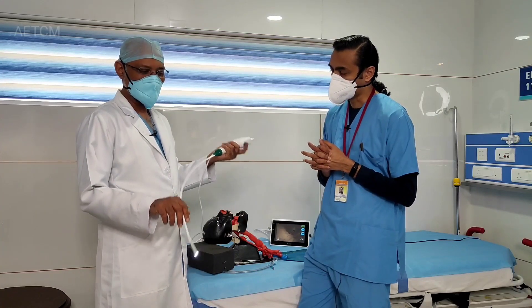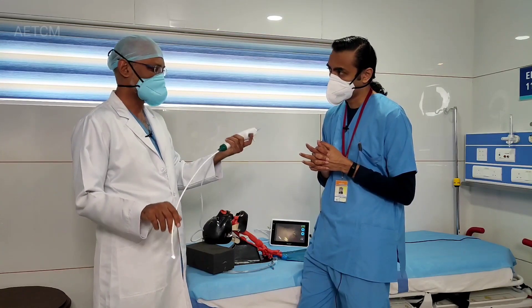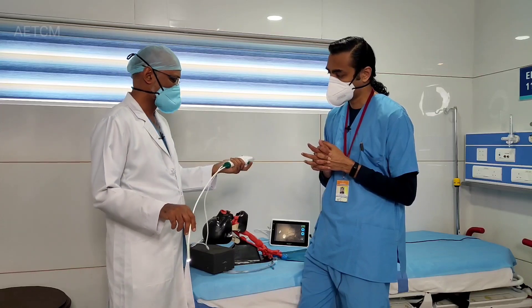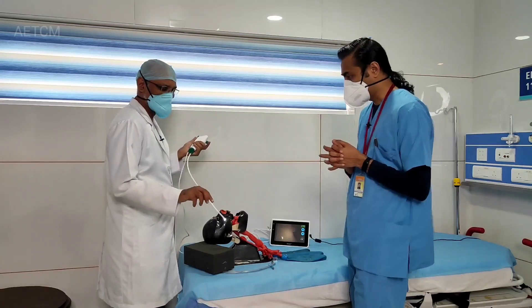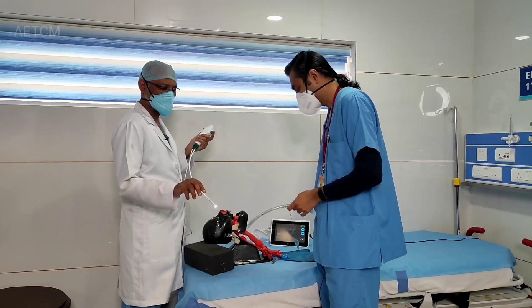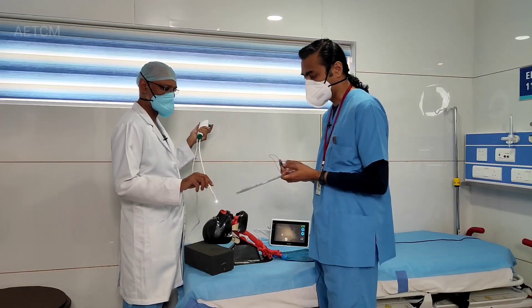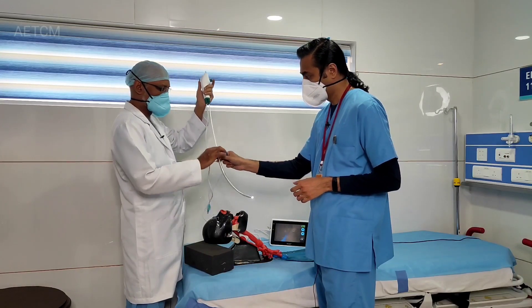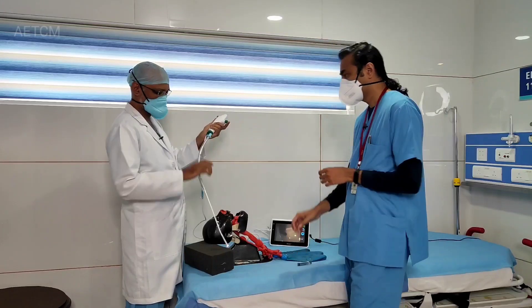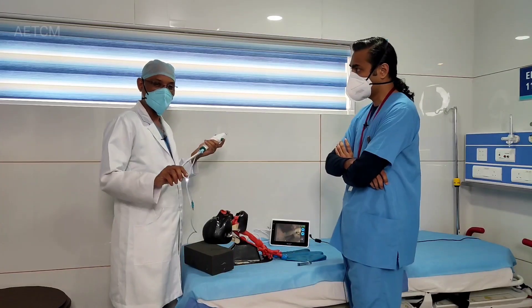Where you prepare the patient and do it before the patient gets into really bad shape. I would recommend a technique of going through the nostril because that is much easier. Prior to that, you may have to anesthetize the patient's airway with some local anesthetic.